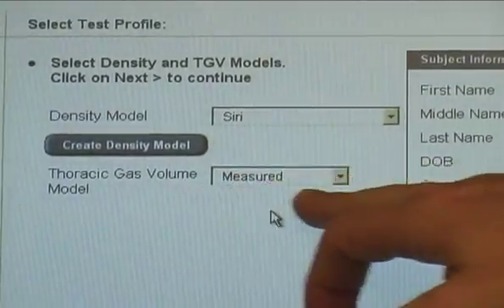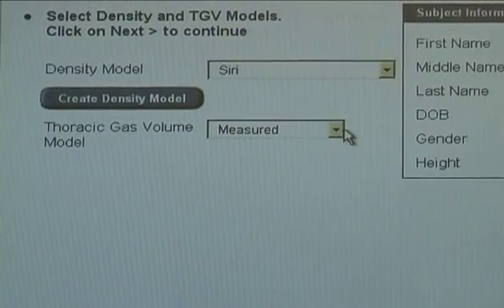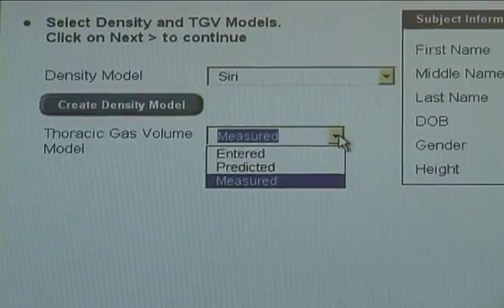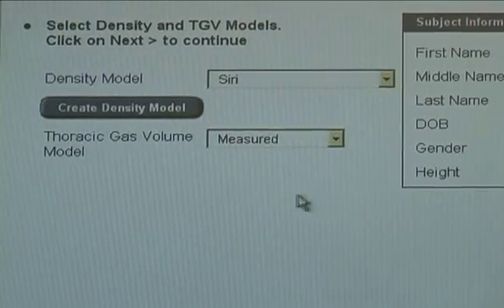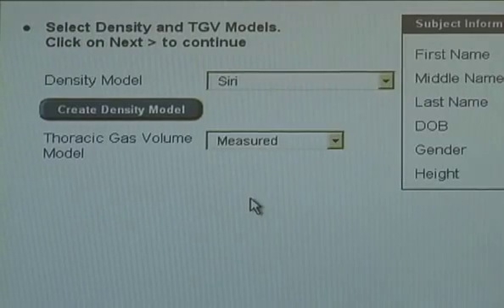And then you have an option to do measured or predicted. And that's residual volume, correct? It's actually thoracic gas volume, which is indigenous to the BOD pod. Residual volume would be the hydrostatic weighing.